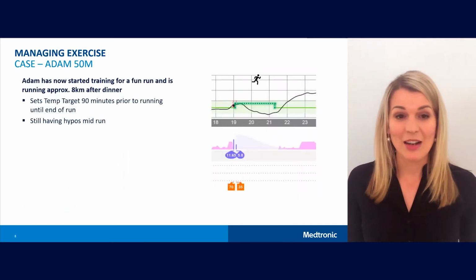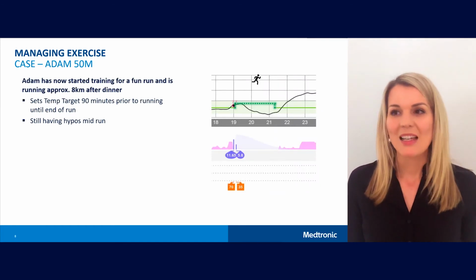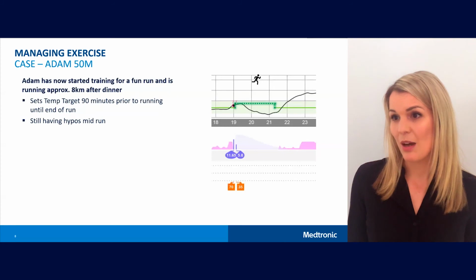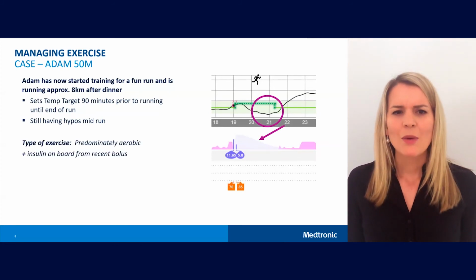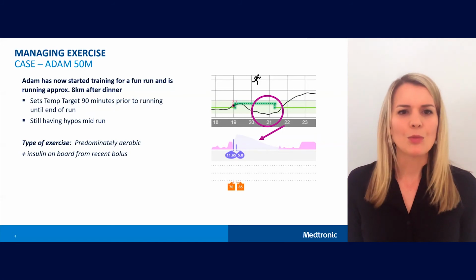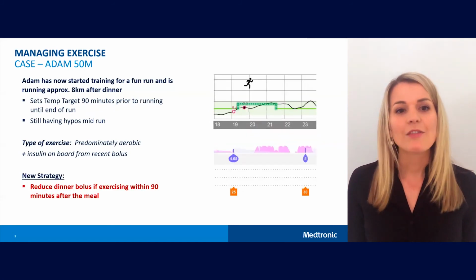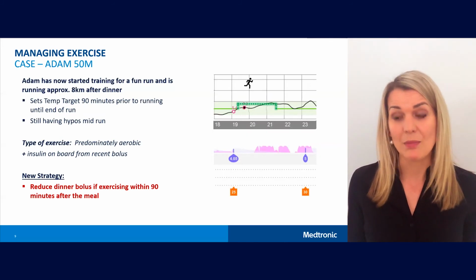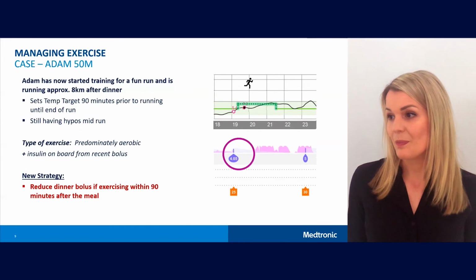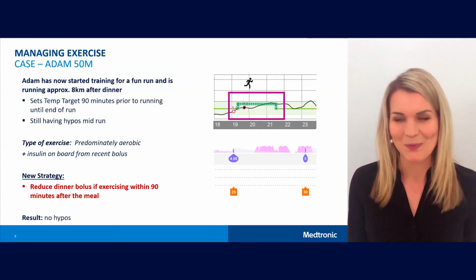Adam has now started training for a fun run and is running approximately 8 kilometres after dinner. He sets a temp target 90 minutes prior to running, but found that he's still having hypos mid-run. We determined that it's probably the insulin on board from the recent bolus that's contributing to the hypoglycemia, and recommend he reduce his dinner bolus if exercising within 90 minutes of dinner, and he's found that this has helped stabilise his blood glucose levels.